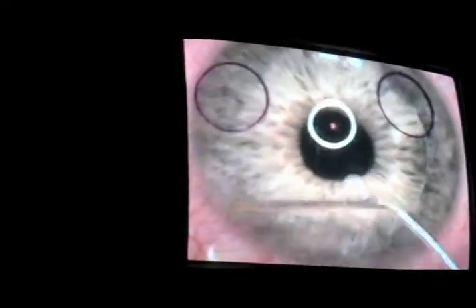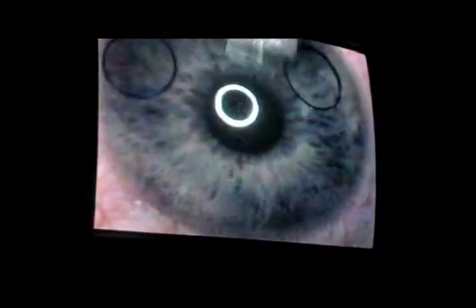And we're away. There's a little pulsating sound. It's a little bit nerve-wracking at first, but I'm supposed to focus on the red flashing light right above me. Even though it is a little blurry, it's pretty easy to focus on. And in under a minute, it's all done. Dr. Hale puts some liquids on there, some antibacterial stuff to keep it hydrated, and puts the flap that he moved back into place, smooths it out so it's back and nice and smooth and there's no wrinkles.